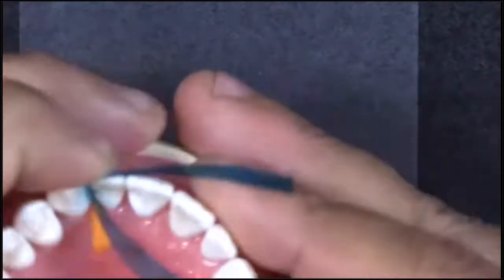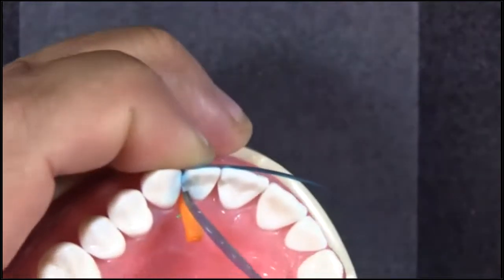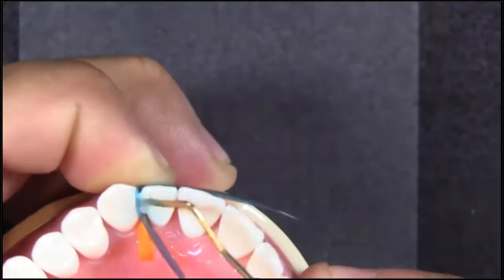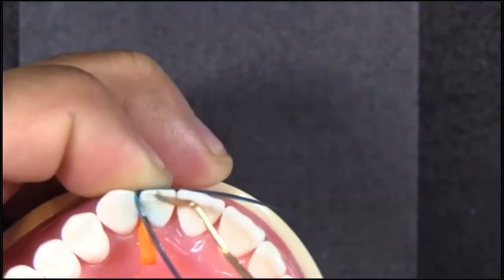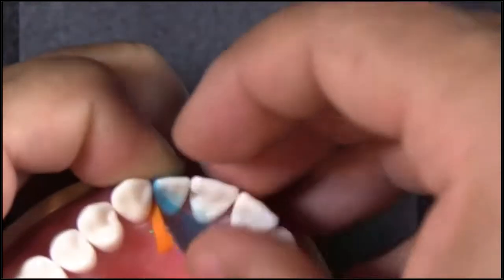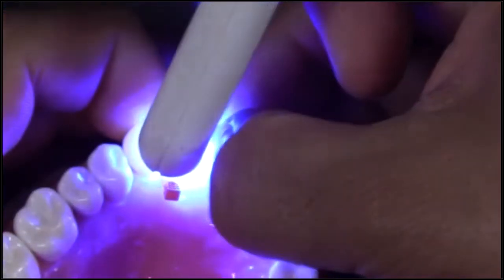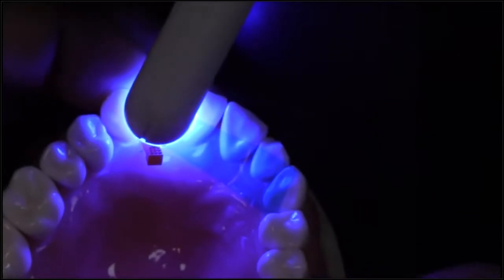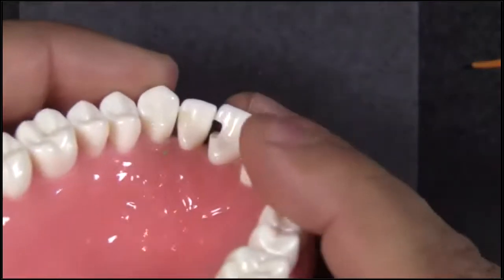and then again, put finger pressure there, a lot of pressure, inject some composite there. I'm going to have Kevin do double duty as my assistant. If I have any excess, I'm going to clean that up so that it's just less to finish and polish. And then I'm going to take this matrix band and curve it, try to match the curvature of the tooth. Yep. And then we're going to take that out. And then we end up with a nice result there.